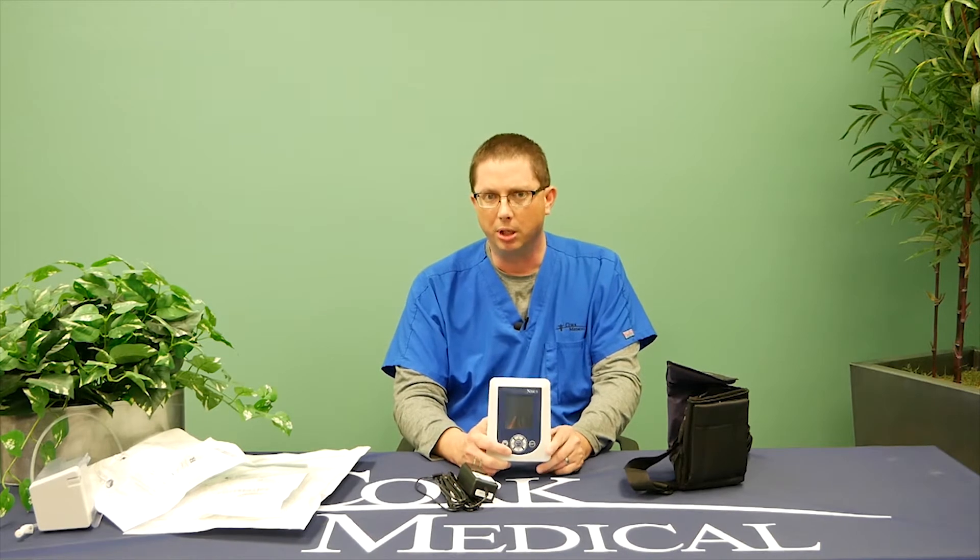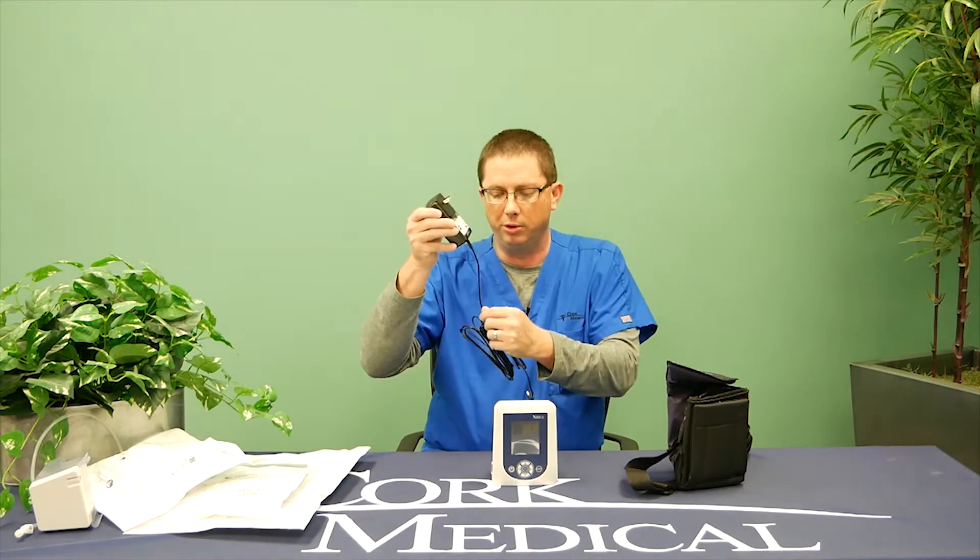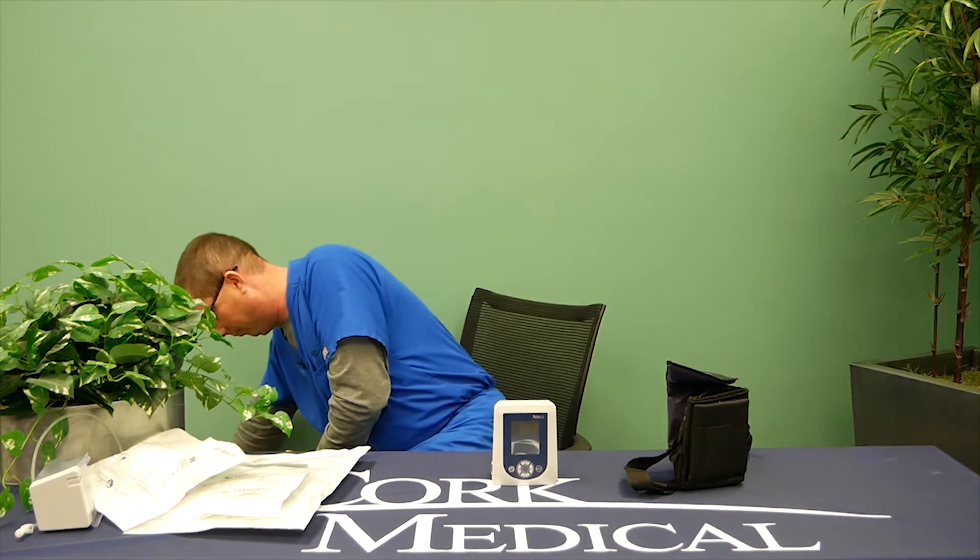One item to know about negative pressure — I want to reiterate — is that this pump is worn and taken with you 24 hours a day. The pump has an internal battery that will require charging. Most patients typically receive eight to 18 hours of battery life. Our recommendation is if you're sleeping or sitting in your chair, plug your charger into a 110 outlet, and ensure the outlet is not on a switch, because we don't want someone shutting off the switch and not being able to charge your device.